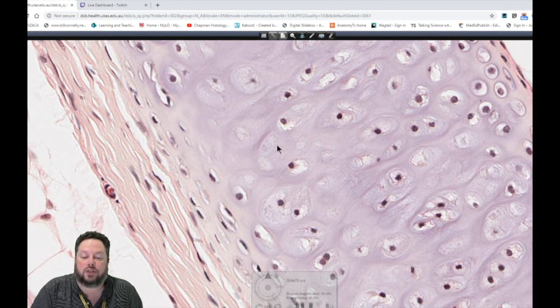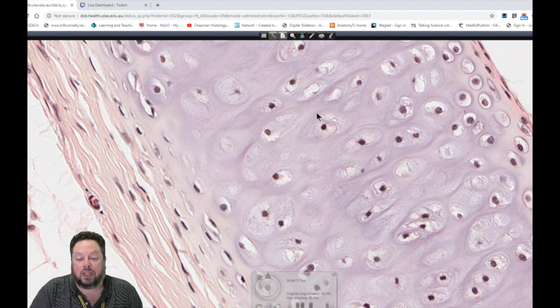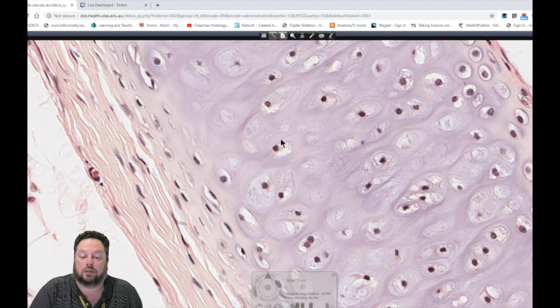In cartilage, because the matrix is a semi-rigid structure, quite a rigid structure, the chondrocytes are actually trapped within these little holes within the cartilage matrix, and these little holes are known as lacunae. Lacunae means little lake, and so these chondrocytes and chondroblasts down here too are trapped within these little holes called lacunae, and they sit there and they're able to maintain this extracellular matrix.